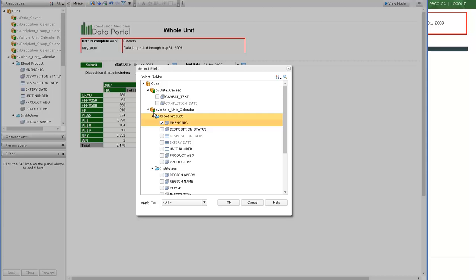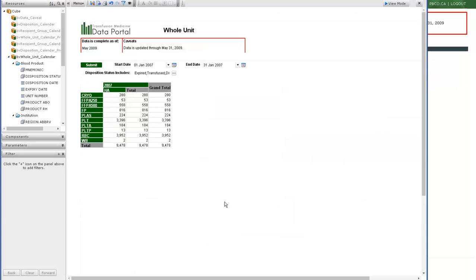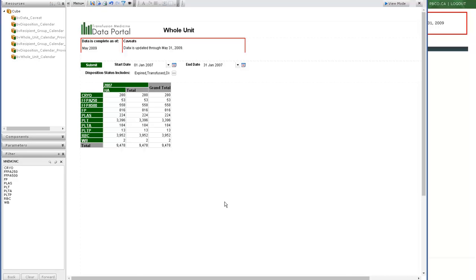Now, in this pop-up filter, we actually have the opportunity to select multiple fields and bring up multiple filters at the same time. However, this really slows the system down because the system doesn't really know which one we want to do first. So always filter one field at a time. And we may have to wait a minute. This is a relatively short list for a relatively short time frame.